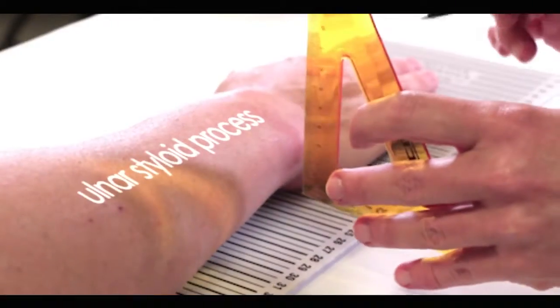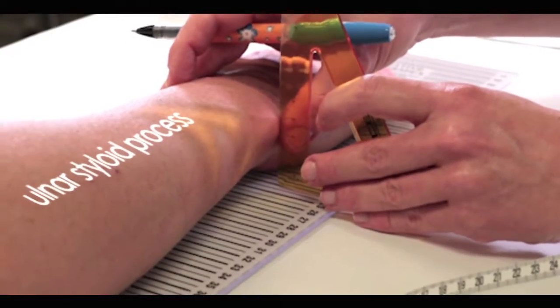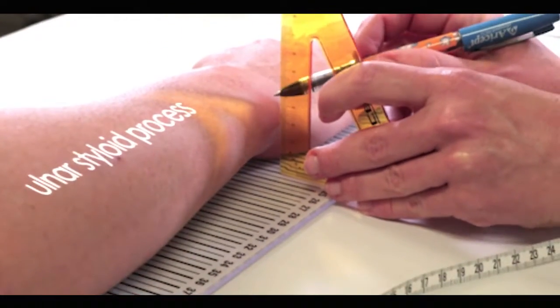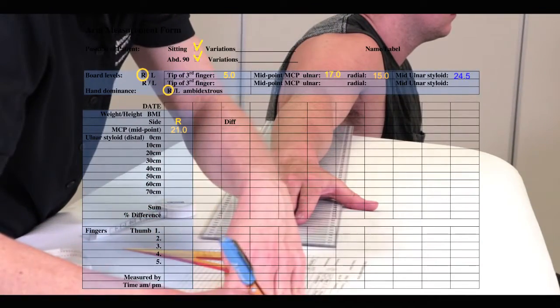Feel for the ulnar styloid process at the wrist and mark the midpoint. This is the zero centimeter point for reference. Record the position on the board on the arm measurement form. In this case, it is 24.5 centimeters.